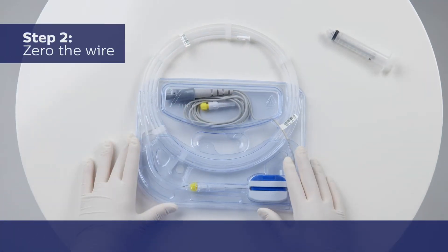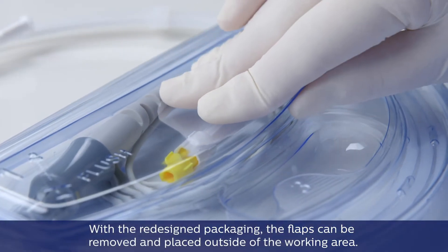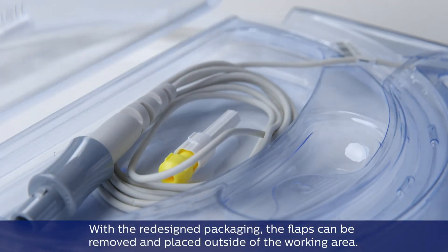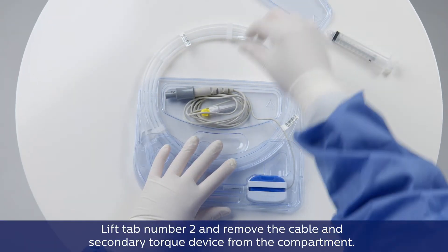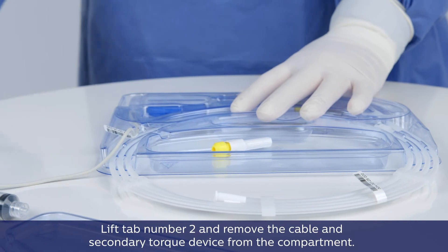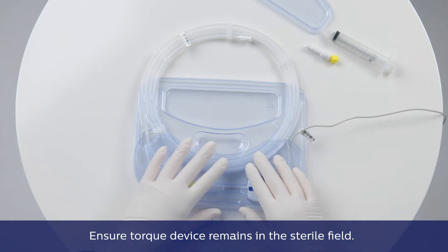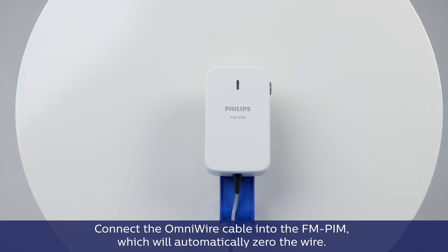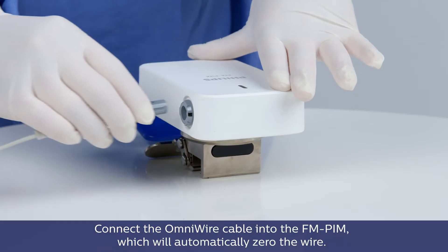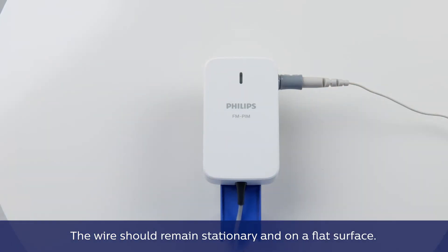Step 2: Zero the wire. With the redesigned packaging, the flaps can be removed and placed outside of the working area. Lift tab number 2 and remove the cable and secondary torque device from the compartment. Ensure the torque device remains in the sterile field. Connect the OmniWire cable into the FM PIM, which will automatically zero the wire. The wire should remain stationary and on a flat surface.